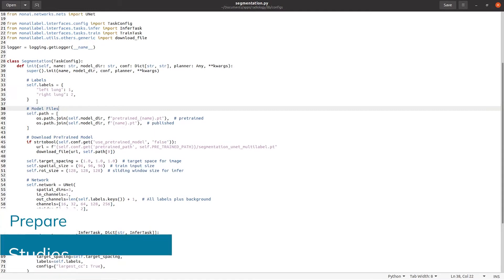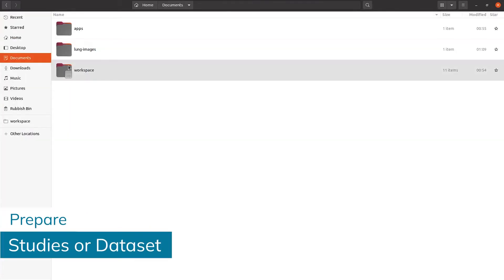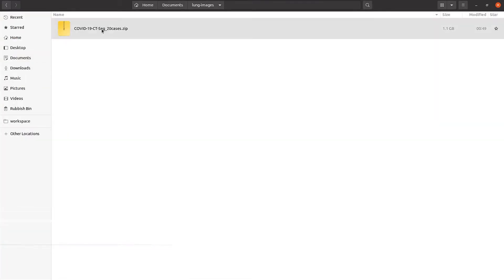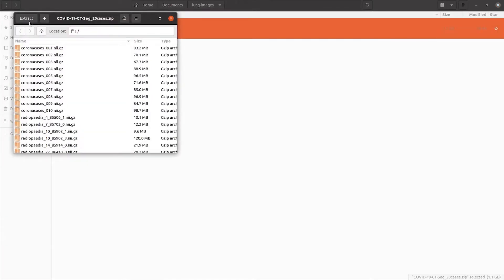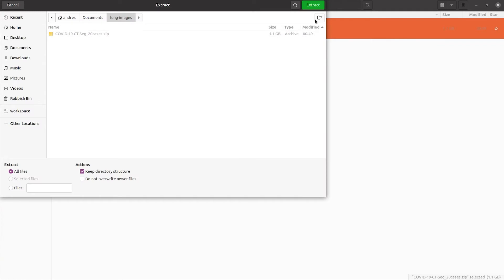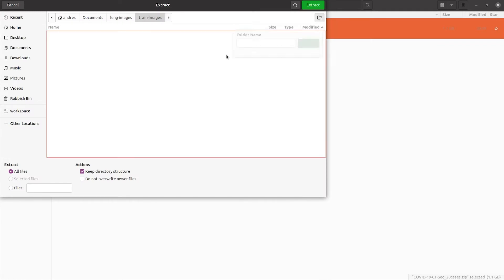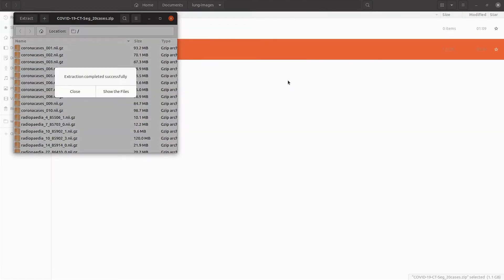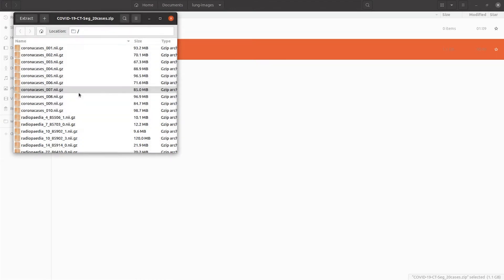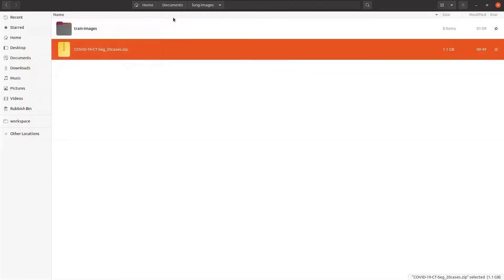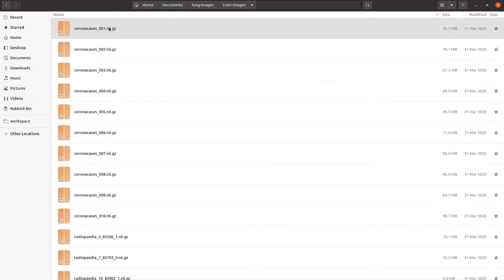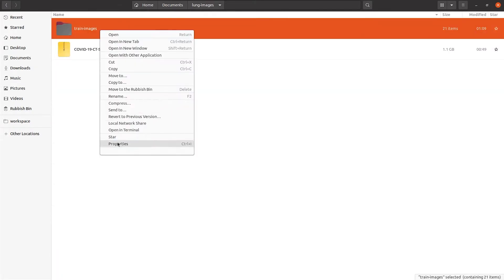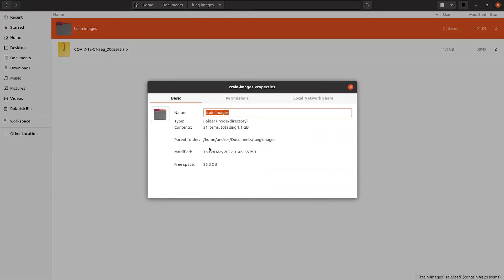Next step is to prepare the data set so Monoilabel can read it. For that, uncompress the file, create a folder and place the images in the folder. Copy the path where the images are located as we need it to start the server.